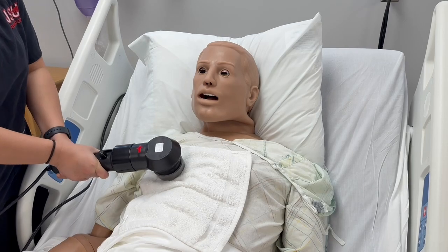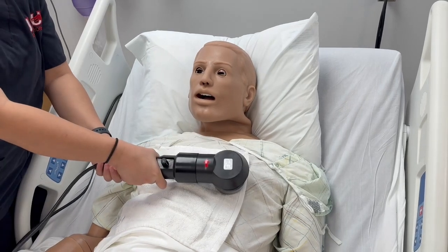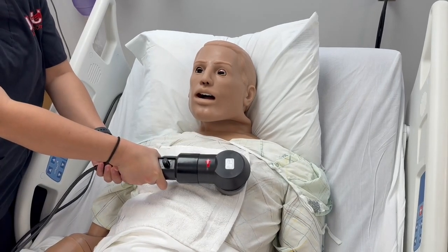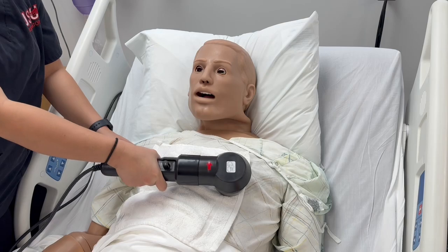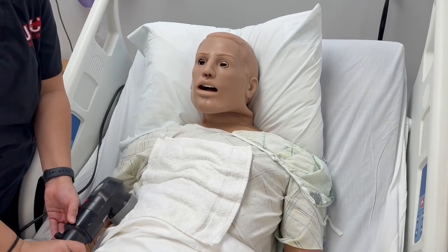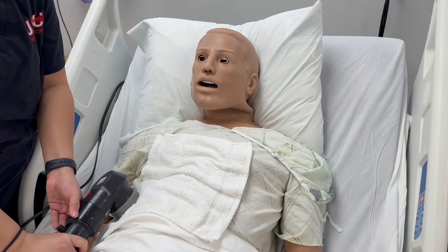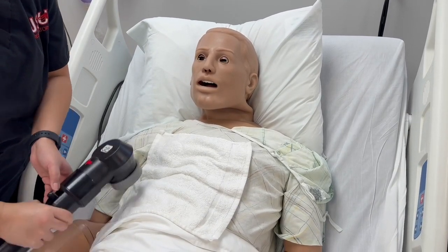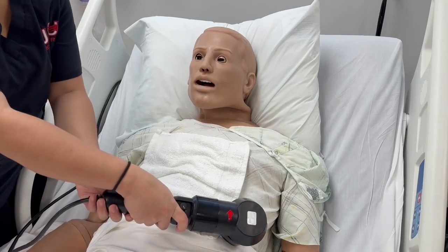While using this device, we want to avoid any surgical sites and bony areas. Also, we want to use this device at least five minutes on each lobe, and it can also be used on the patient posteriorly.